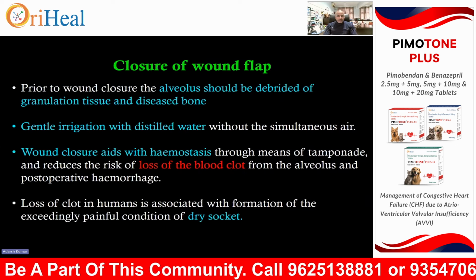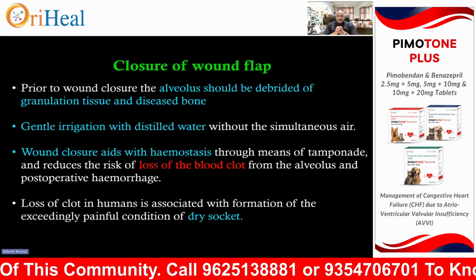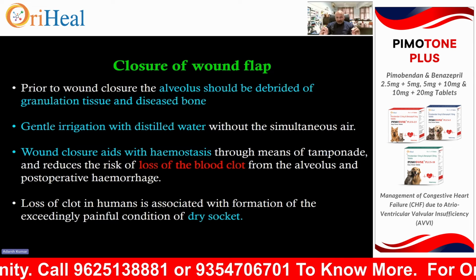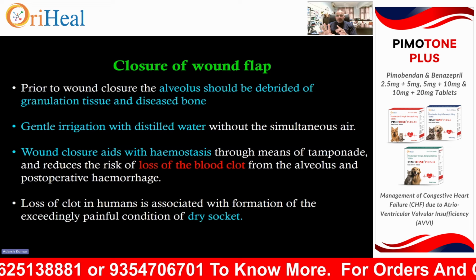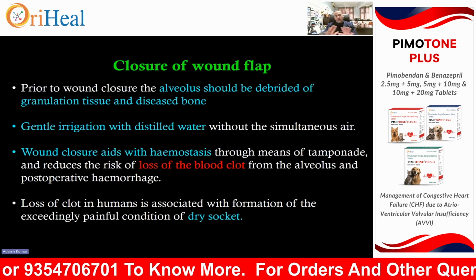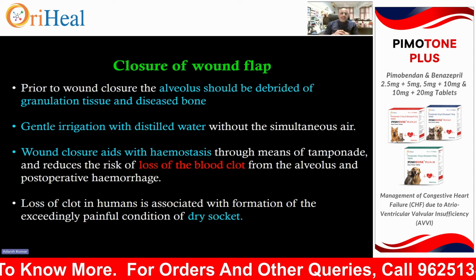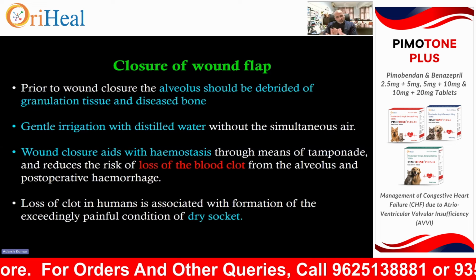Now you have to close the wound flap. Ideally, whether you are doing a surgical extraction or a simple extraction, flush and then suture it. Put the animal on antibiotics. Literature says that all the sockets created by either simple or surgical extraction are to be flushed and sutured. The wound has to be closed.